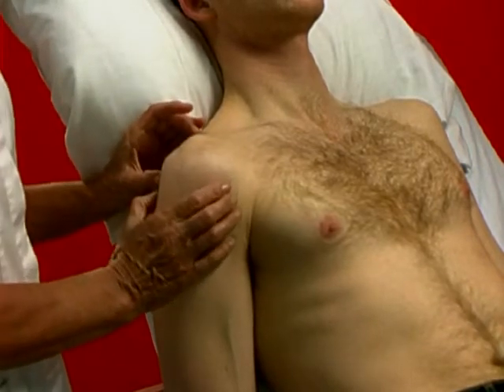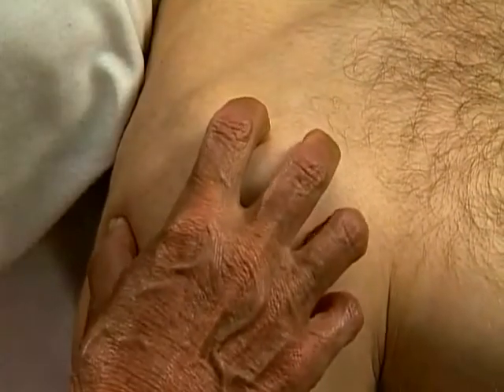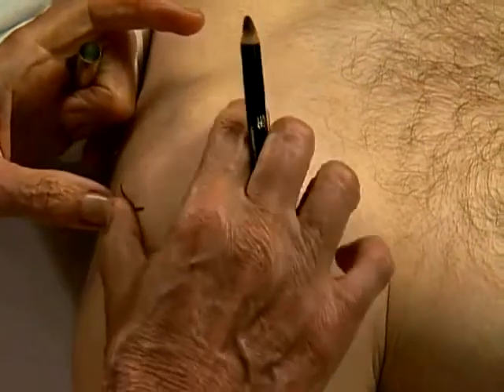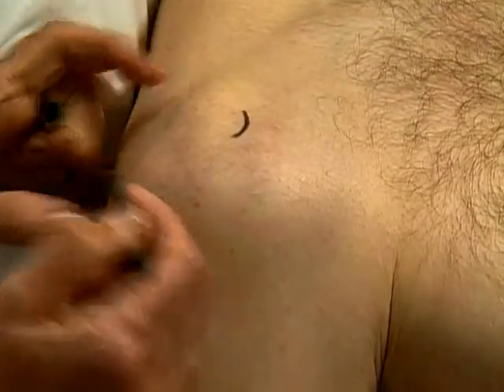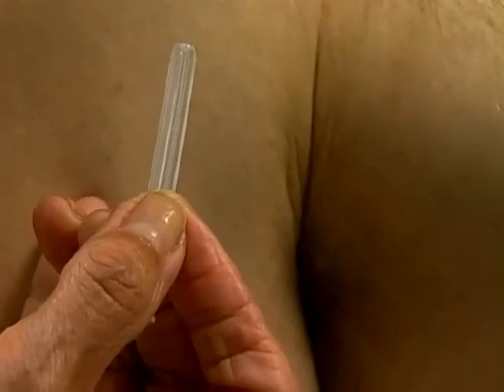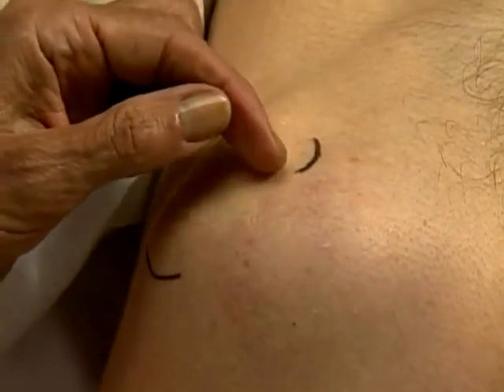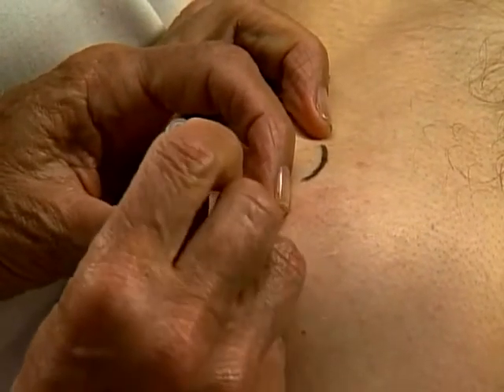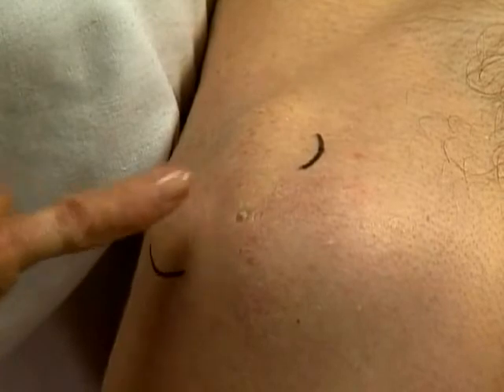Palpate the posterior angle, the anterior angle and the lateral border of the acromion. Using a sterile needle guard, identify the midpoint of the lateral border. Stretch skin very tightly and press there firmly. A small circle marks the entry point for the needle.